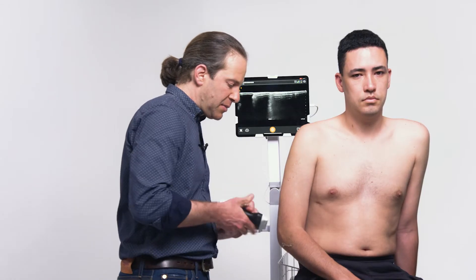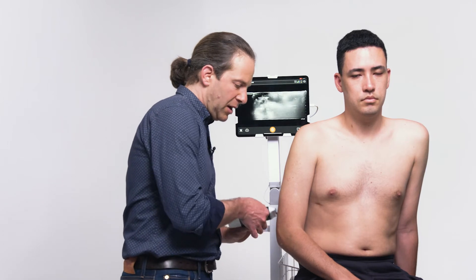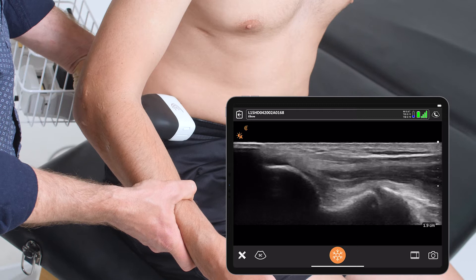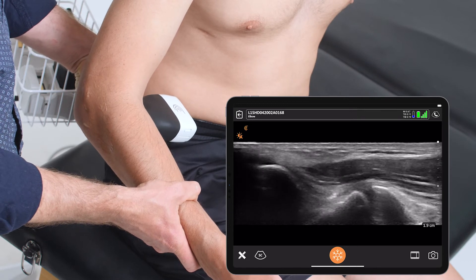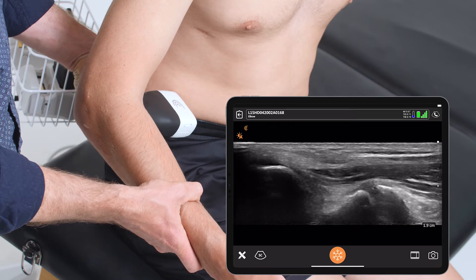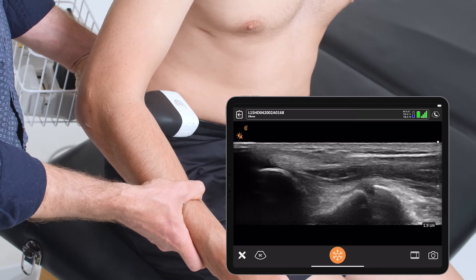I'll repeat the same scan on the medial epicondyle. I have to switch hands for the scan. Now looking at the common flexor tendon that comes and inserts here on the medial epicondyle, again looking for fluid, calcification, or disruption.